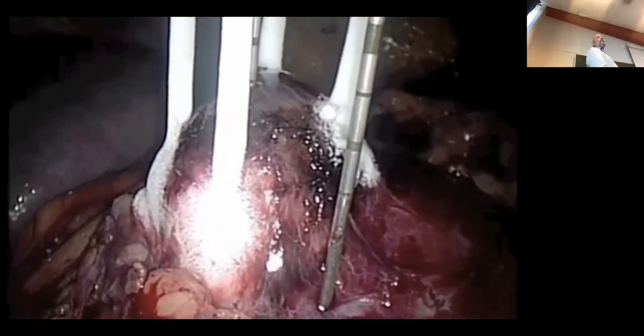I have a question because you said the patient was lying on his side. Yes. And then the kidney is slightly pushed against the skin. Yes, but on the bottom side or the upper side? If you're lying on your left side, you're being operated on your right side. If you're lying on your left side, this kidney is usually pushed against the skin here. Okay. And we can end up with a snow cone or snowball like that.